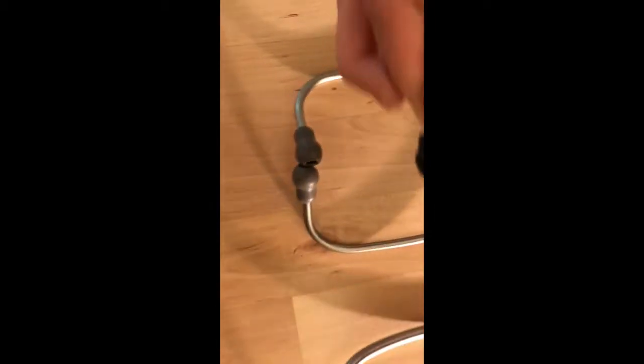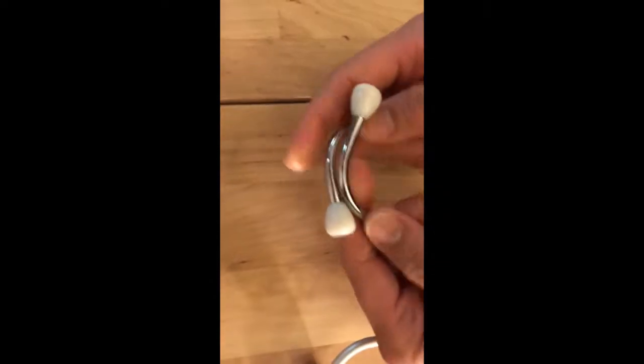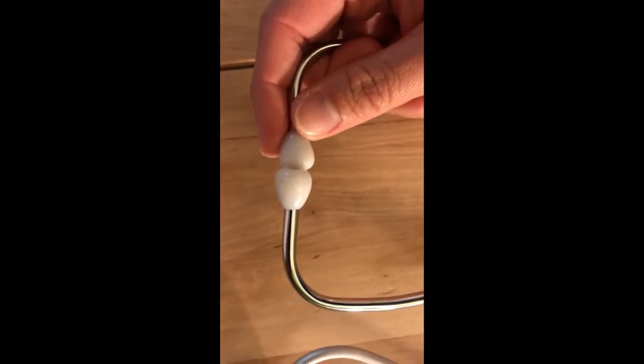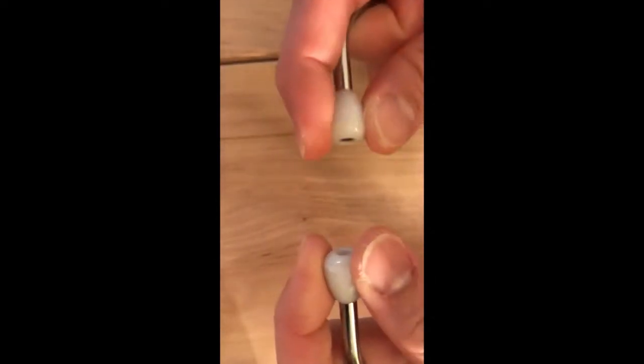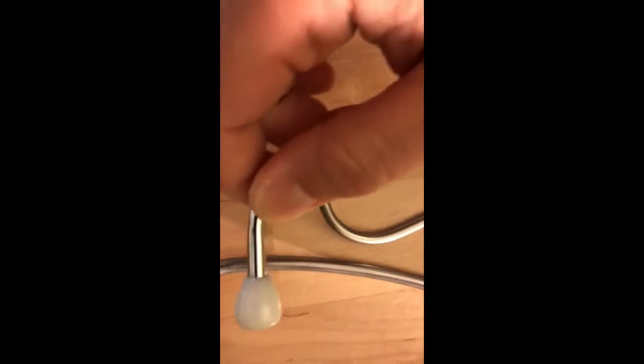The last one is the ordinary non-branded stethoscope. You can buy it at a cheaper price, or sometimes they give it for free when you buy a blood pressure machine. This one is stiff, and the size is the same as the Rely On — way smaller than the ear tip for the Littmann and Echo Core. So for the ear tip, Echo Core and Littmann are the good choices.